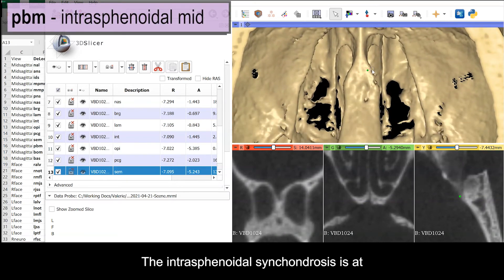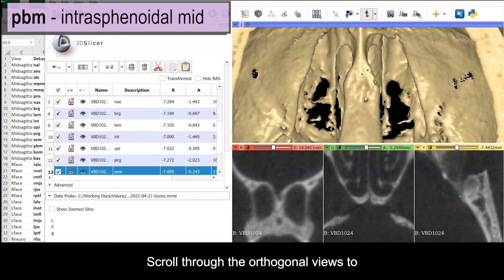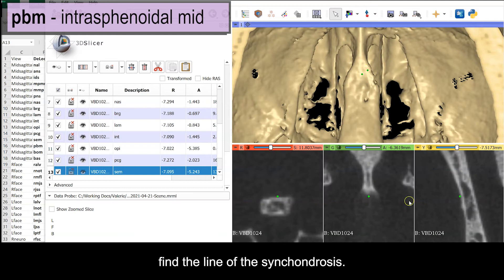The intrasphenoidal synchondrosis is at the junction of the presphenoid and the basysphenoid on the endocranial surface. Find the expanded area in the cranial base posterior to the optic canals. The synchondrosis is usually just rostral to them. Scroll through the orthogonal views to find the line of the synchondrosis. It's usually visible as a line of radiolucine or dark voxels.